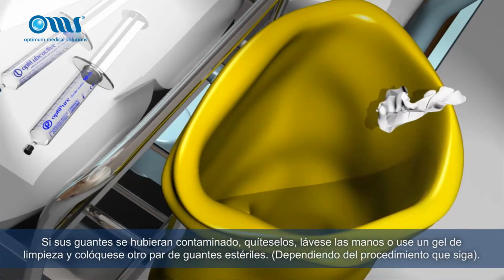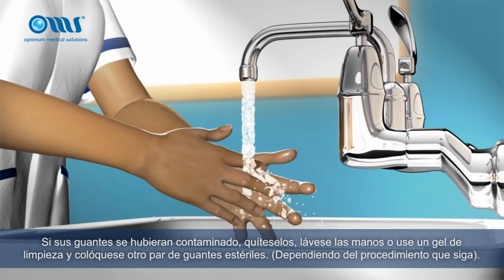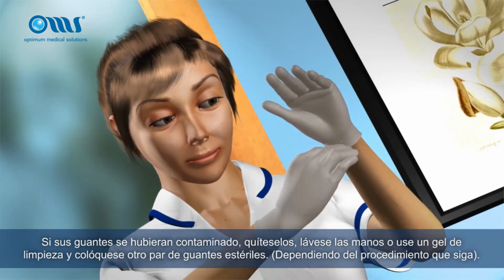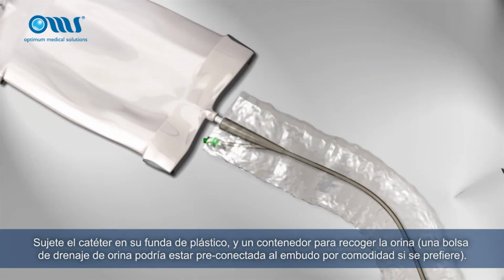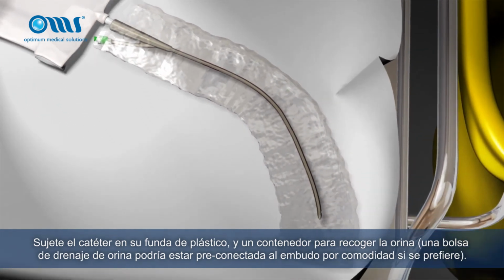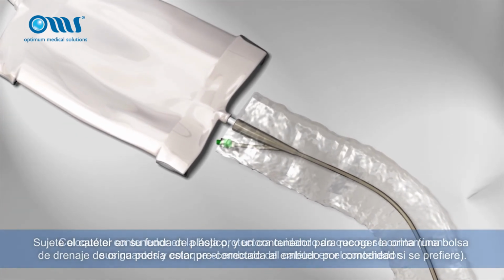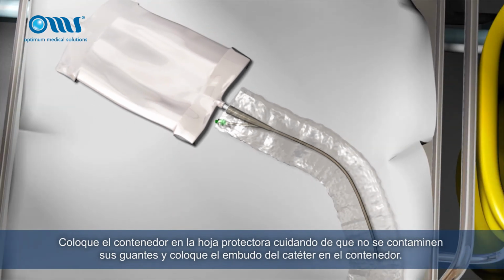If your gloves have become contaminated, remove them, wash your hands or use a suitable cleansing gel. Then put on another pair of sterile gloves, depending on which procedure you follow. Take hold of the catheter in its plastic sleeve and container to collect the urine. A urine drainage bag may be pre-connected to the funnel for convenience if preferred. Place the container on the sterile sheet, taking care you do not contaminate your gloves, and place the funnel end of the catheter in the container.